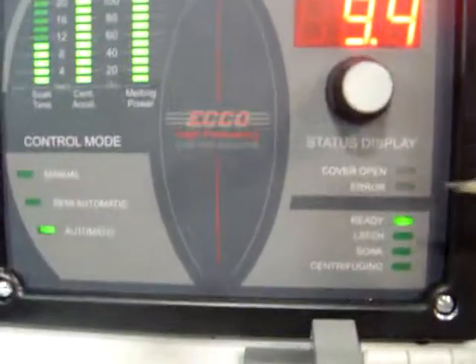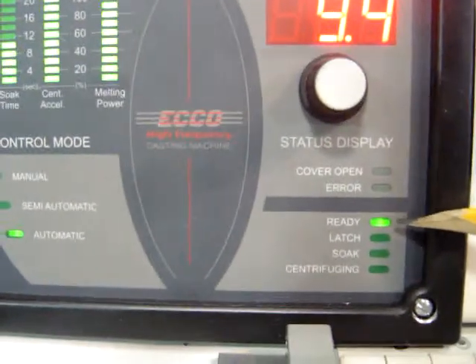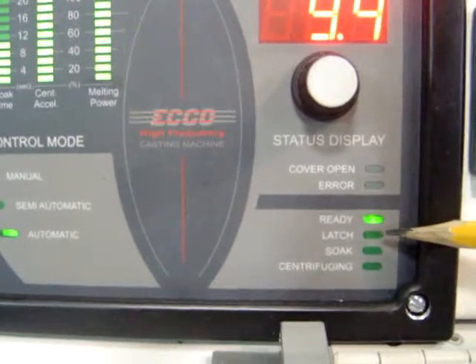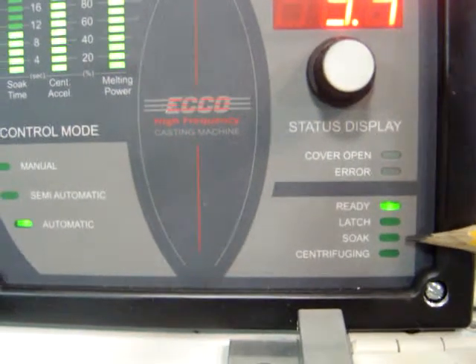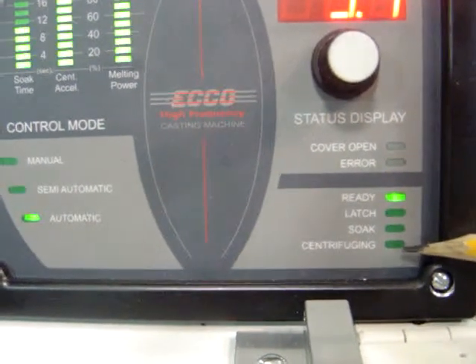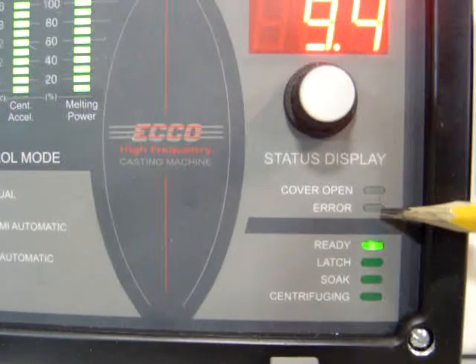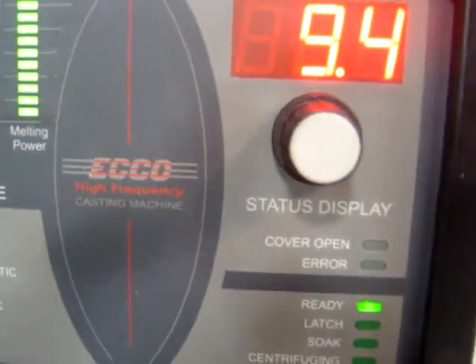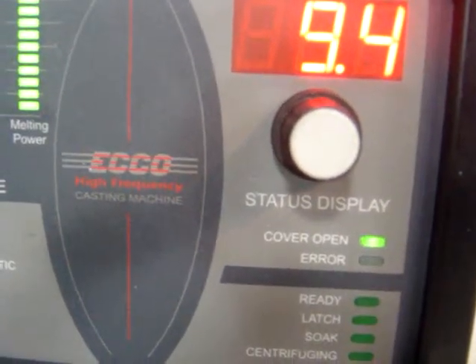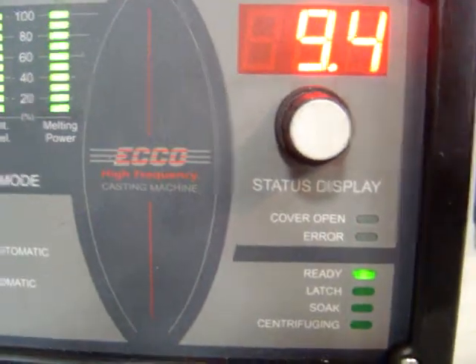Other displays on here: you have your ready light which tells you that all of your faults are in good shape. You have your latch light which tells you that you're either melting or casting. Your soak light if you're soaking, and when you're centrifuging, the centrifuge light. Above here there are two other lights: an error light and a cover open light. The system will not melt or cast when the cover is open. If we crack the cover, you'll see that that light illuminates and indicates to the operator that the cover is not completely closed.